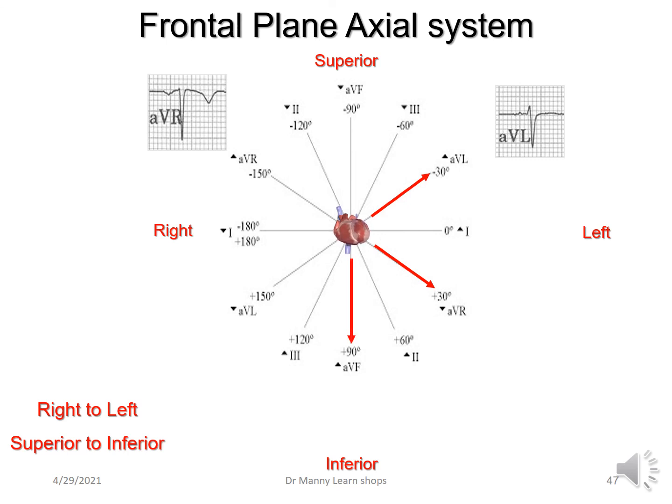If it's going to AVF, it will be positive. Because in an adult heart, the left ventricle exerts the most influence on the ECG, because it's 5 times larger than the right ventricle. So therefore, in relation to the atria, it's a lot bigger.